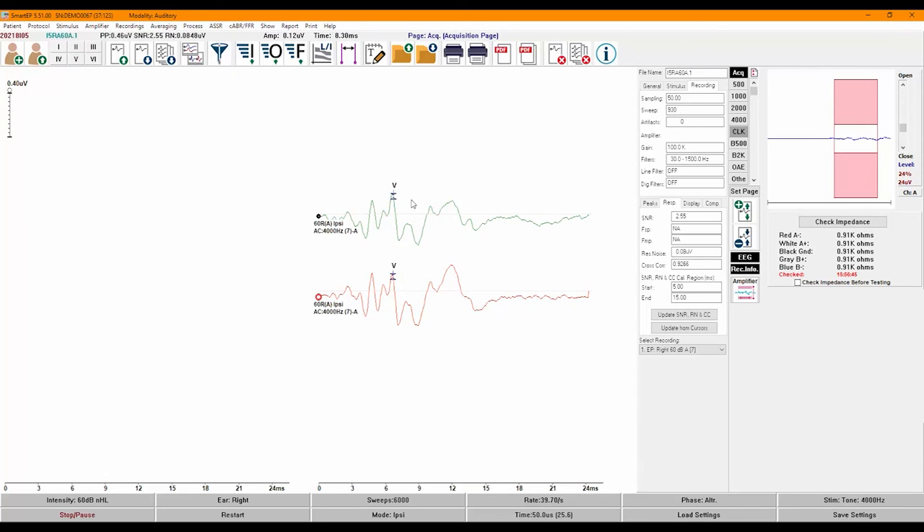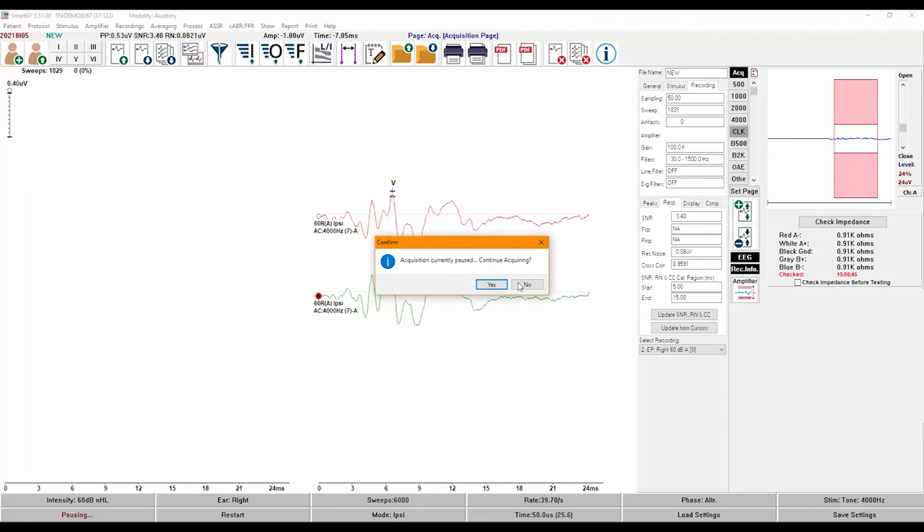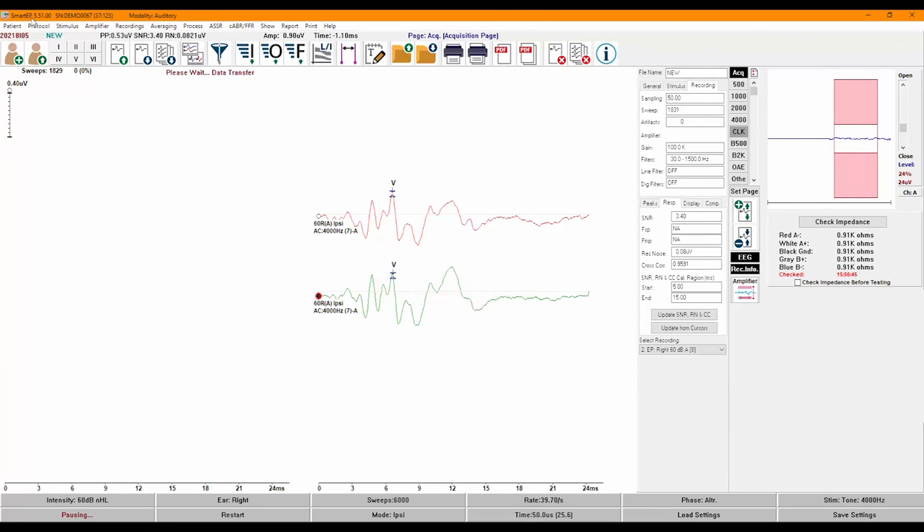I will continue recording and go over some of the buttons on the toolbar, from left to right. The left icon allows you to create a patient file, and the button next to it opens an existing patient file. Next, you will find the peak labels that apply to the type of auditory evoked potential you are recording. Since we are in ABR mode, we have the labels for peaks 1, 2, 3, 4, 5, and 6.